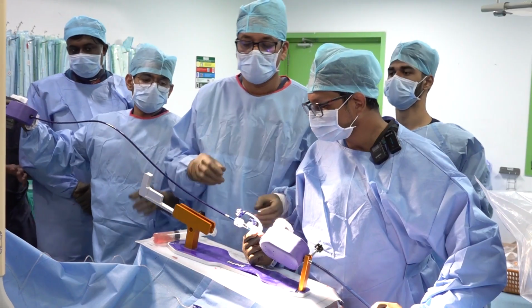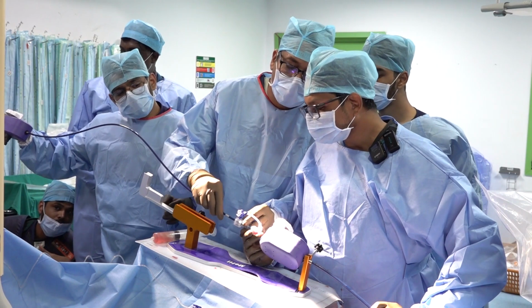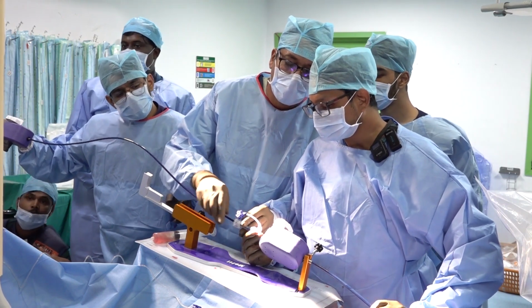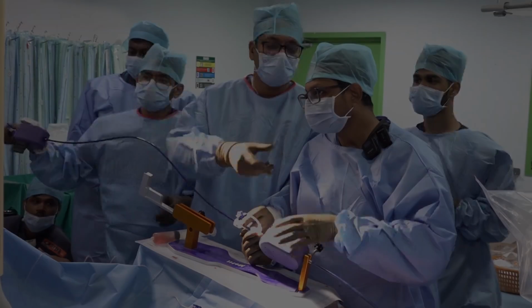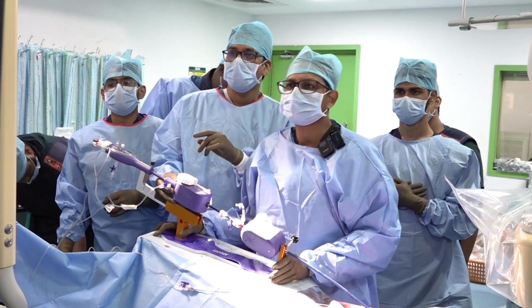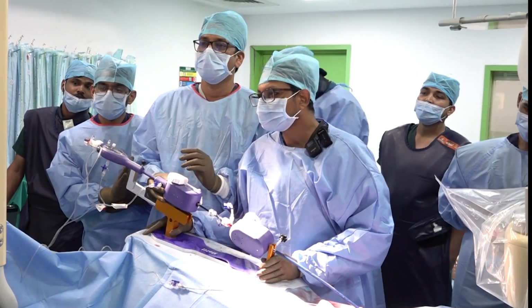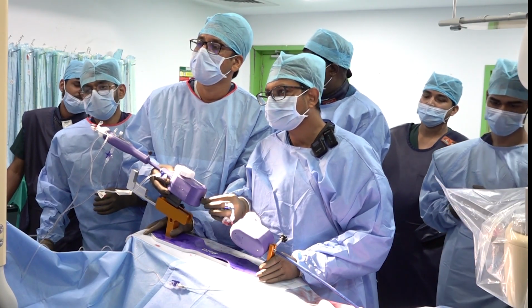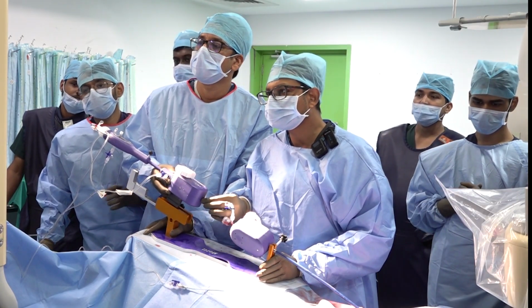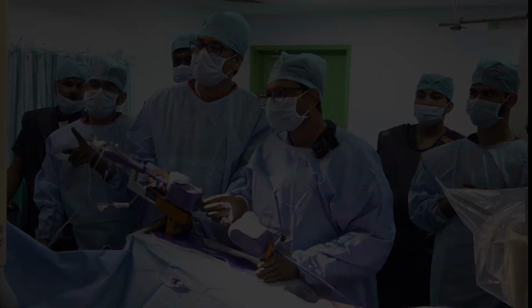Now you can align the lines. A little posterior, sir. A bit more anterior. You can advance it, sir. Yes, yes, yes. Advance it a little bit more. Pull it back, sir. A little bit. Perfect. Now you can sandwich the clip, sir.